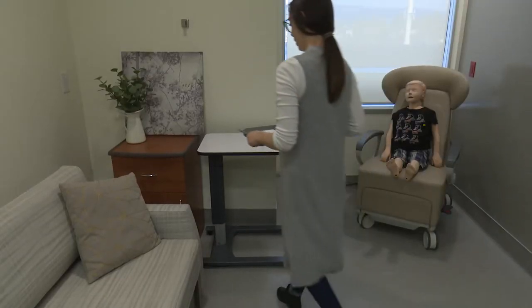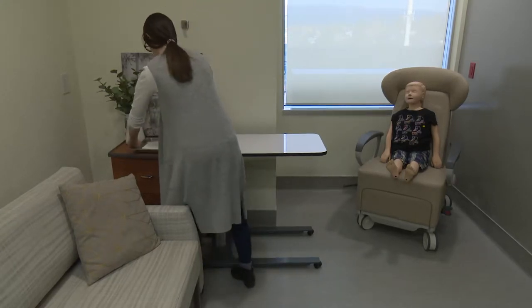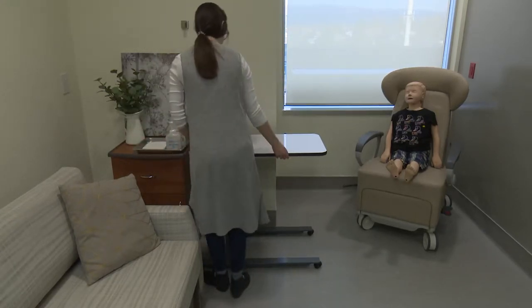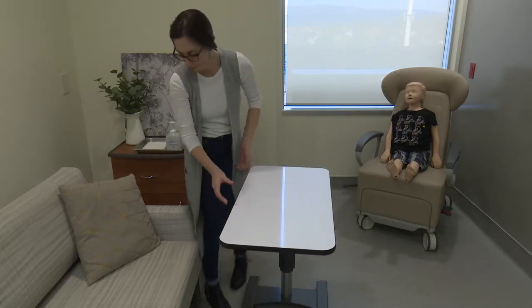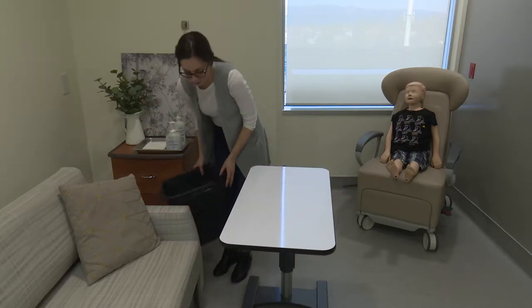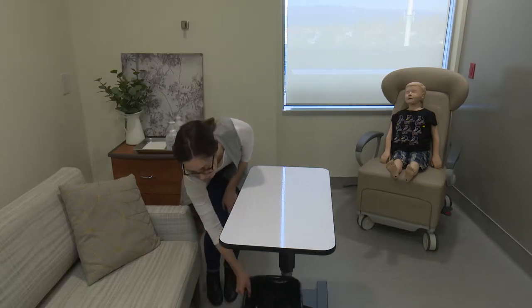When you have finished preparing yourself and your supplies, you will need to pick your location. Ideally, you will have a table or a counter next to a bed, sofa, or chair that is comfortable for your child to be still in for a few minutes.